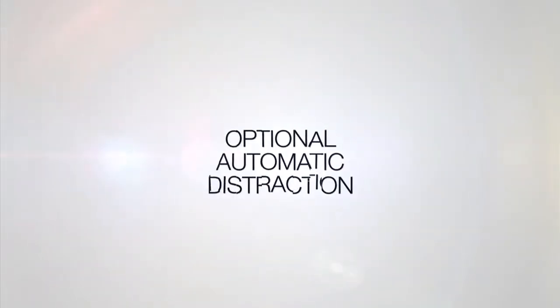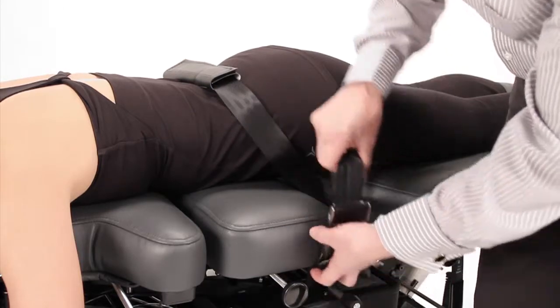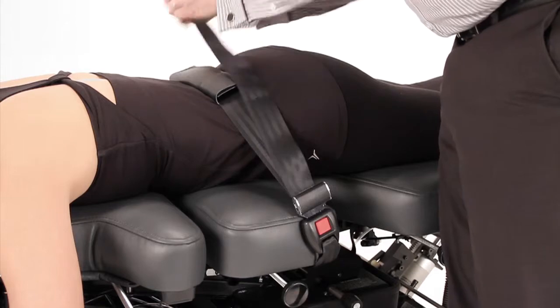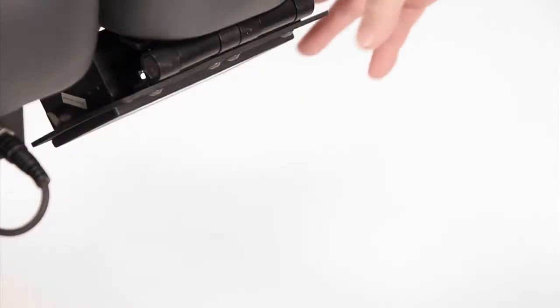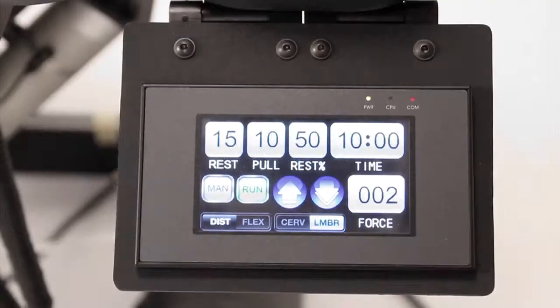Adding the option of auto distraction turns your AirFlex into an effective traction table. Use the provided seatbelt to help stabilize the lower back of your patient. Use the touchscreen to control your automatic traction settings. The rest setting controls the seconds that the patient will be in a rest cycle. The pull setting controls the seconds that the patient will be in the pull cycle.